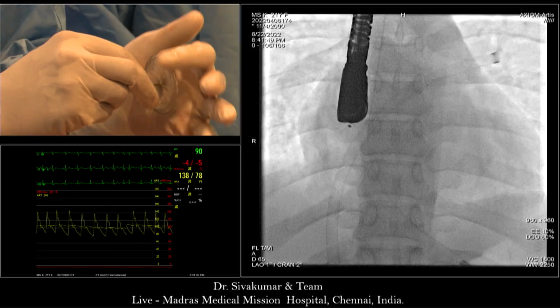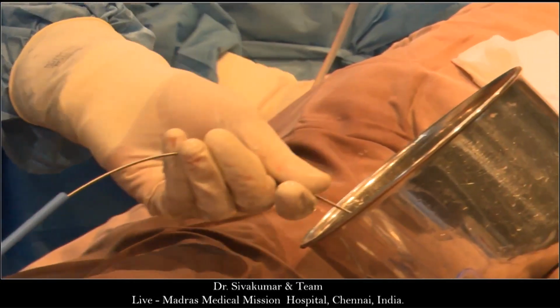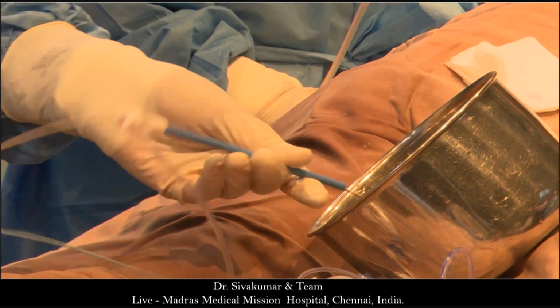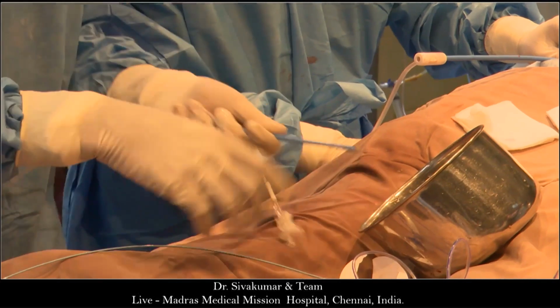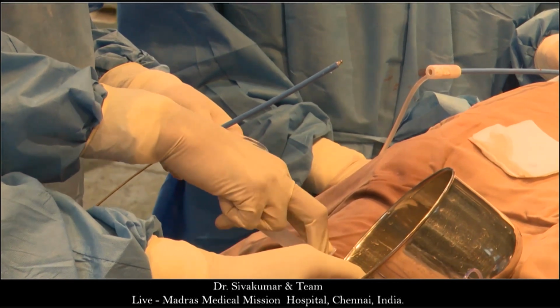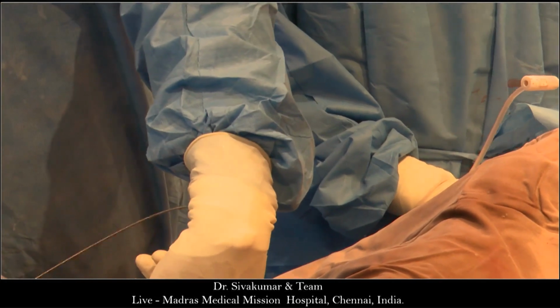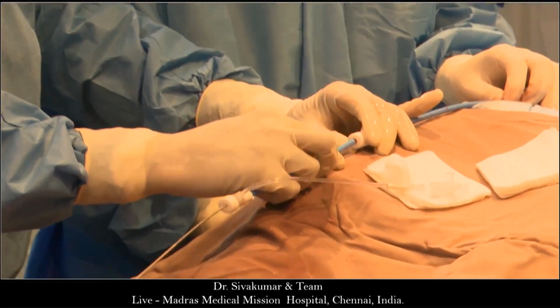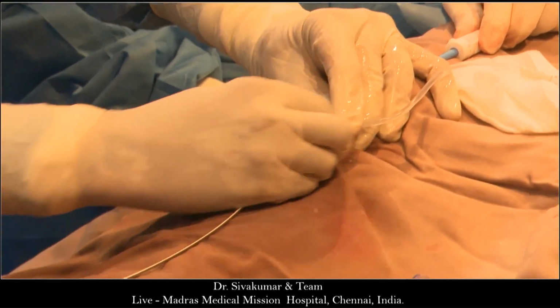Heparin was given about 40 minutes before. Bharat, do you check ACTs or just keep? We check it if it is more than 1 hour. Within 1 hour, 100 units per kg we give, and that's it. Okay, so now interestingly, 10 years ago, 100 units per kilogram gave us an ACT of about 300. I don't know whether anyone else experiences, and now 100 units per kilogram with inflation often doesn't give us above 250, and I have no idea why that is. But it seems to be universal in the UK at least. Maybe Brexit again. Brexit again. We're getting the cheap heparin in the UK. Yeah.